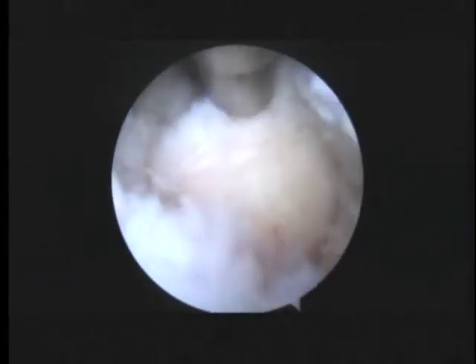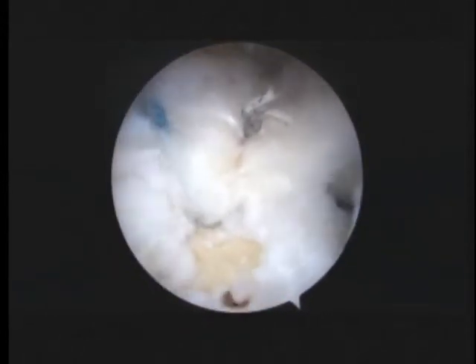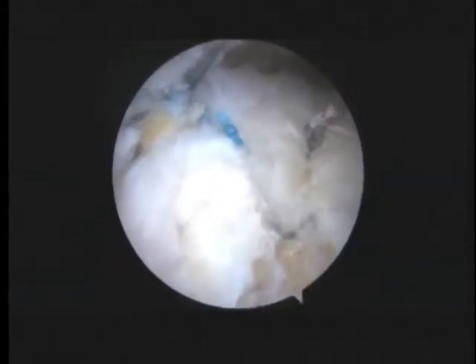Okay, so yeah, we finished the repair. We also made a little hole in the bone there to help get some biological healing going. So here's our 3 suture repair. There's 1, 2, 3. That looks very good there. And our biceps suture is the white suture in the front. So we're going to finish up and get you back to the recovery room.